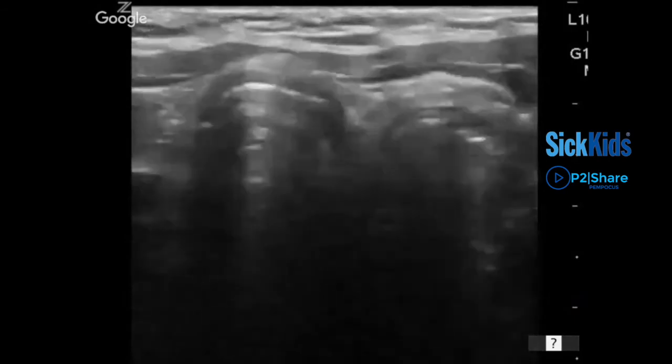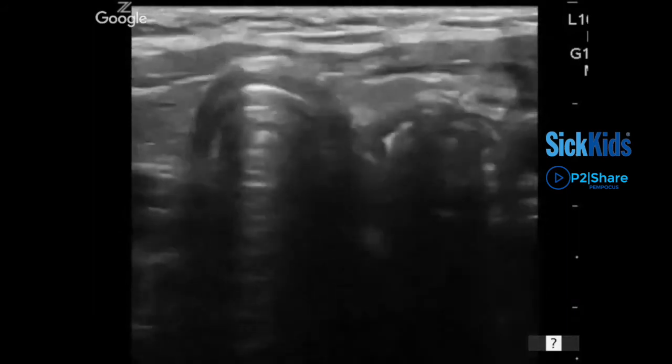That's the beginning. Double trachea, you're totally right. So initially in this video, we're seeing the trachea here on the right, and on the left, we'll just wait a second, there'll be double trachea. So it looks like 2 tracheas are there. It's not that there's actually 2 tracheas there, it's that you have your ET tube in your esophagus. So it's not for tracheal intubation that you for sure know it's in the trachea, it's that you know that it's not in the esophagus, and that's how you confirm tracheal intubation.